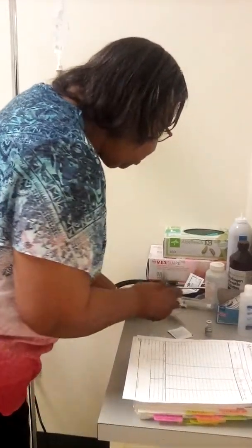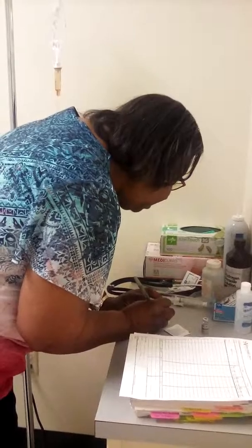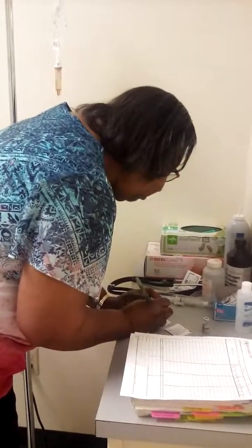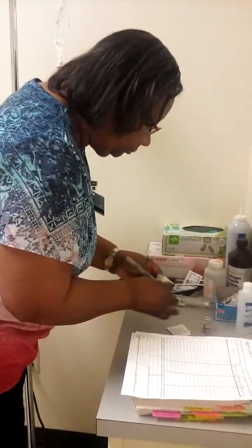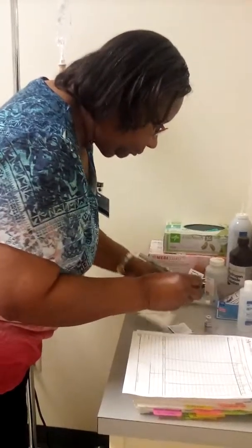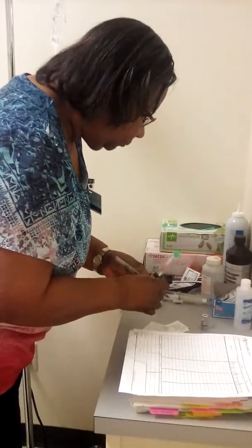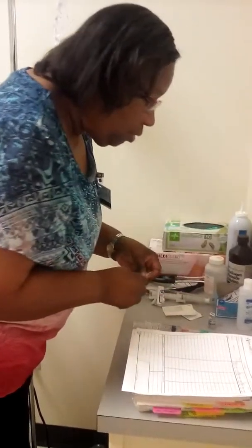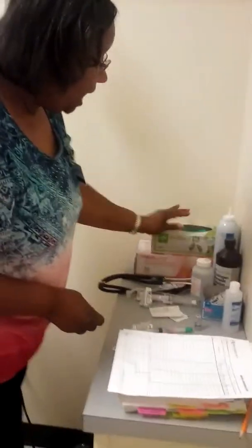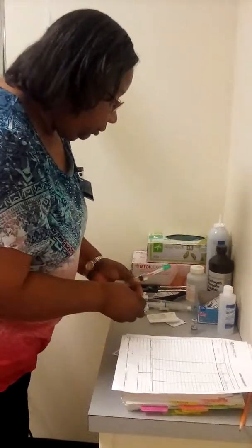I'm going to label my syringe, and on my syringe I'm going to put the patient's name, the drug that I'm giving, the amount that I'm giving, and my initials. If the patient had an INT, I would take gloves to the room for the INT. So I'm going to the patient's room.